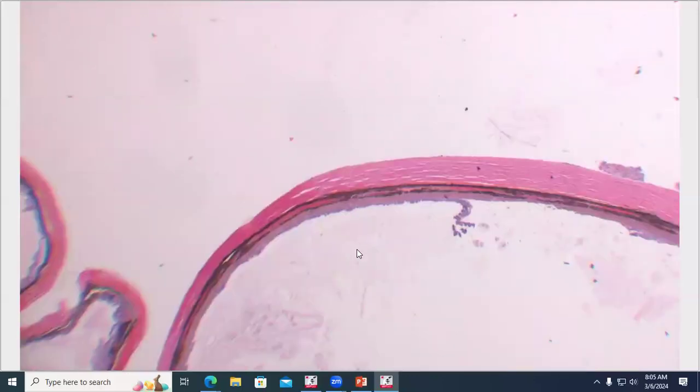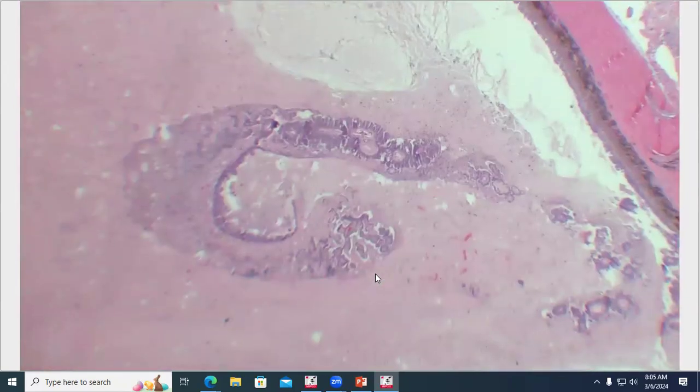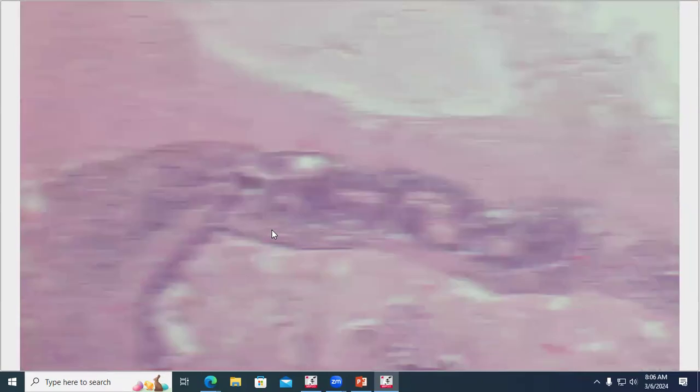And as we go back, you can see those same cells are lining the exposed choroid there. They are infiltrating and effacing the optic nerve and extend right to the optic nerve margin. And they are also infiltrating and effacing the retina. And the retina, other than being infiltrated where you can still tell that it's retina, which is even debatable here, is otherwise necrotic. So probably this is due to ischemic necrosis.